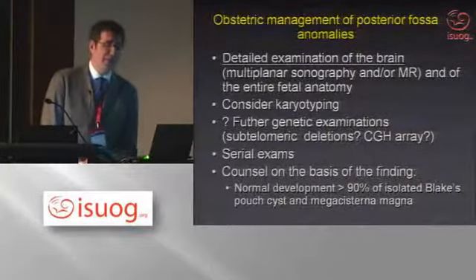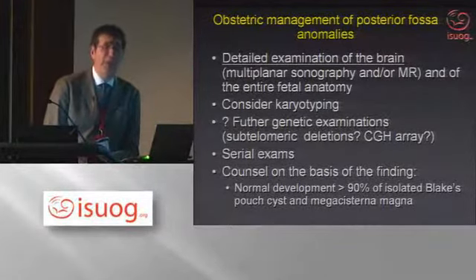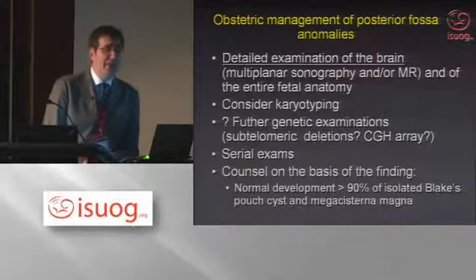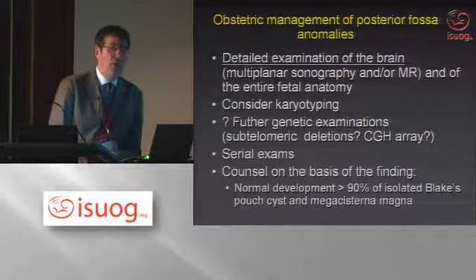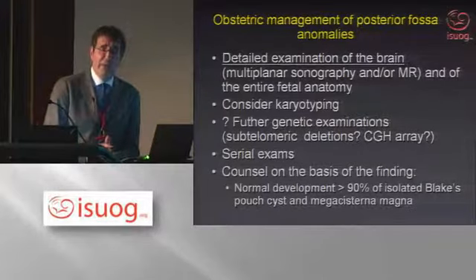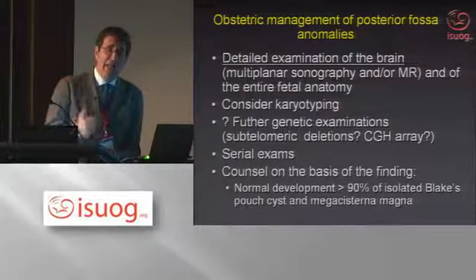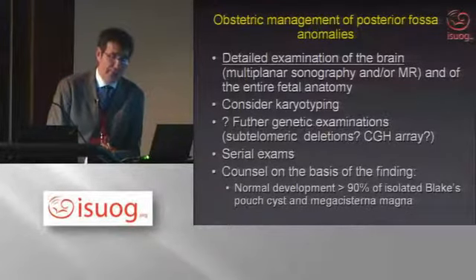Obstetric management of posterior fossa anomalies. Well, the most important thing, really the clue, is a detailed examination of the brain. And the detailed examination of the brain should include multiplanar sonography. That is, you have to examine the brain of this fetus from many points of view, and the most important ones are the axial and the sagittal plane.